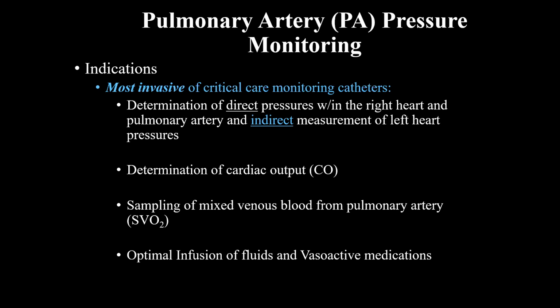So most invasive, it gives us direct and indirect measurements. Here's what's important. The catheter is only in the right side of the heart, and it ends up in the pulmonary artery.